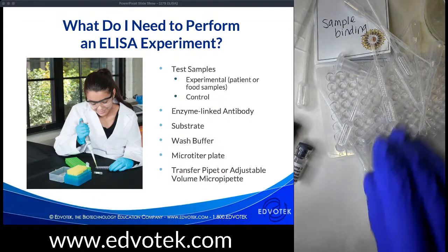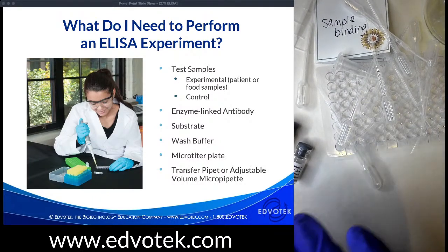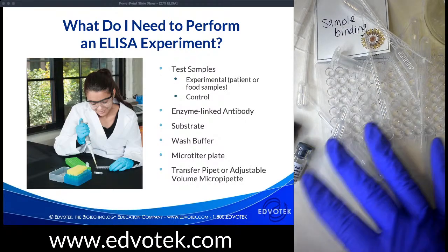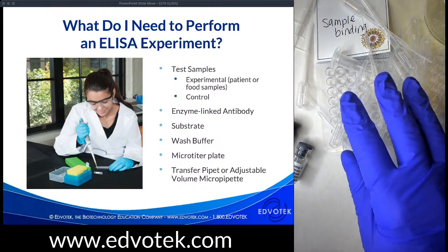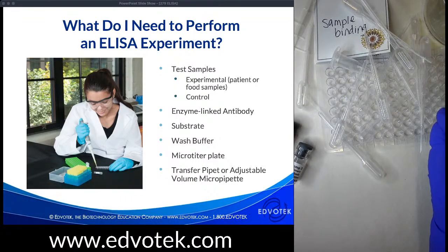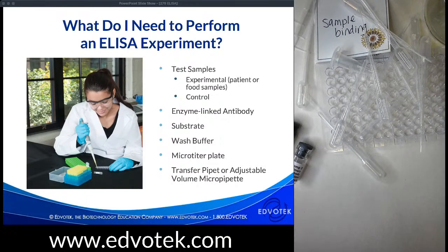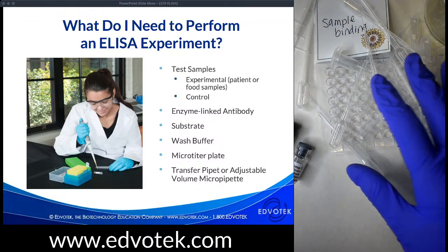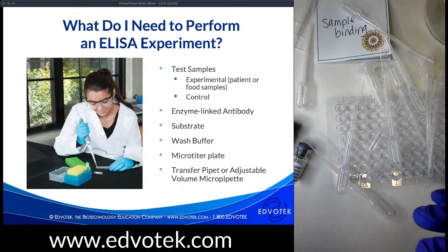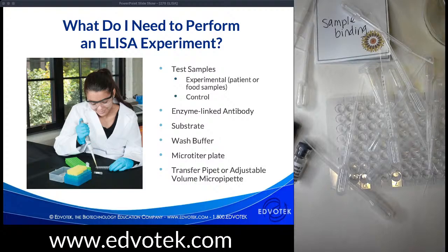And so I think at this point it is important to acknowledge that science can be messy. These types of experiments do have opportunities for cross-contamination between the wells on the plate. But even experiments that don't work according to the manual are a learning moment where we can learn important lessons about data interpretation, reproducibility, and other areas that it's important to emphasize with your students happen in science.